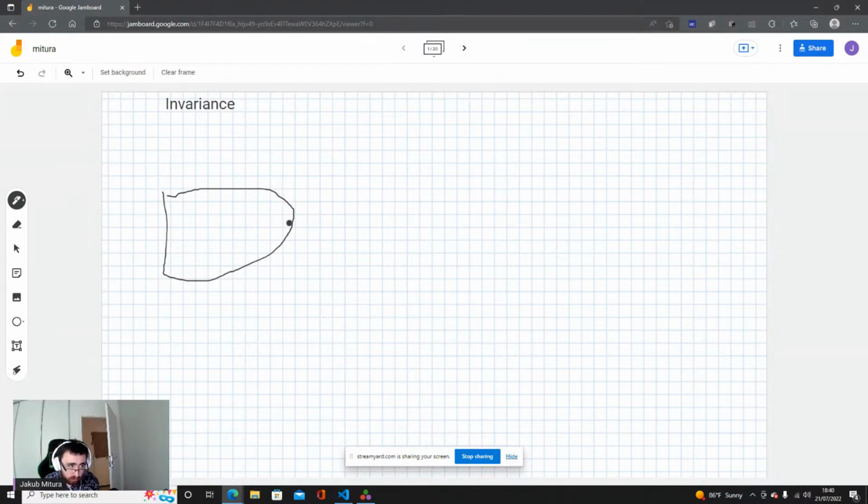It should be invariant to translation. Basically, convolutional neural networks are invariant to translations. It should be invariant to some rotation, usually. It's not always the case, but usually.